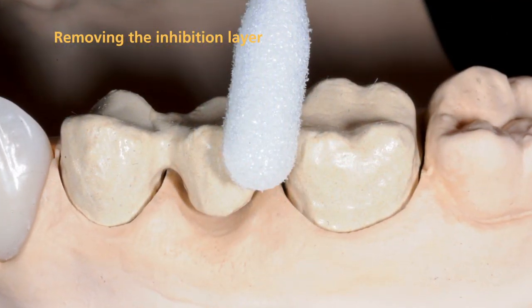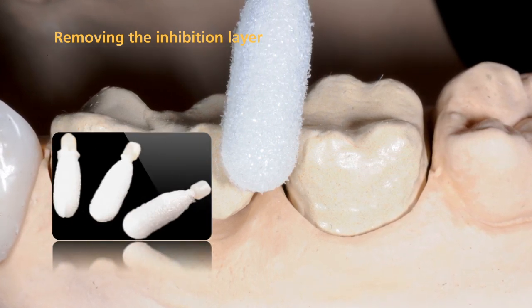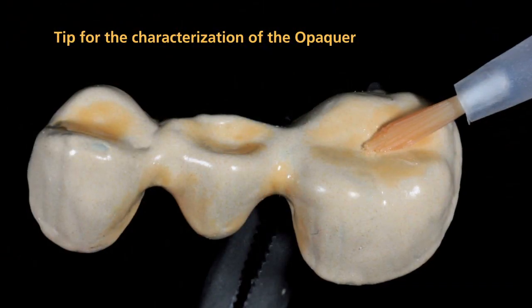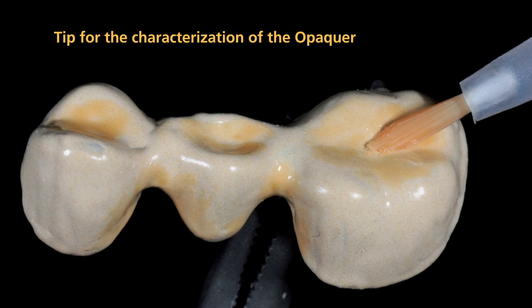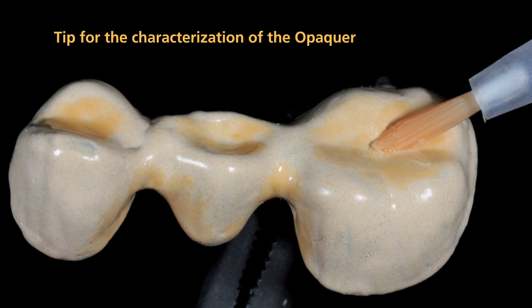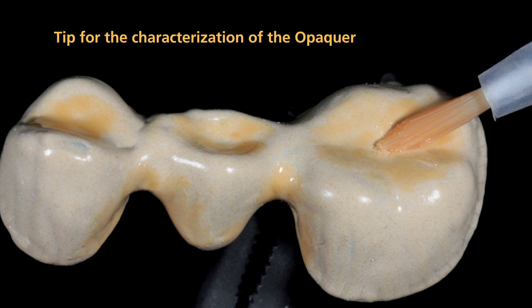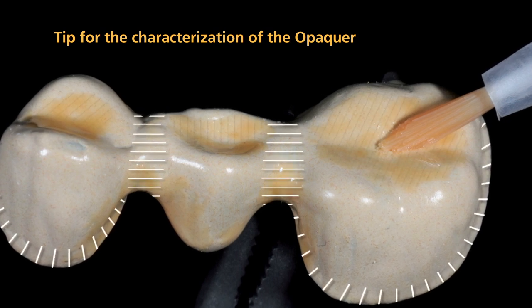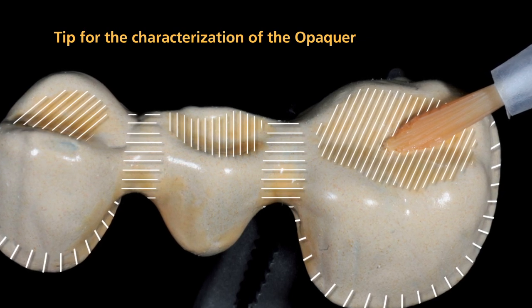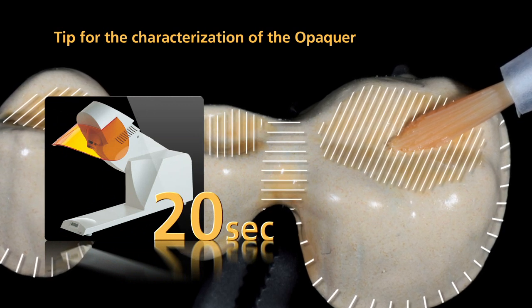Thoroughly remove the resulting Opaquer inhibition layer with a disposable sponge. Make sure that the Opaquer surfaces are free of residue. After you have removed the inhibition layer, you may characterize or modify sections of the Opaquer surface with SR-NEXCO stains. It is recommended that you apply a thin layer of stains to the marginal and interdental areas, particularly if space is limited, to enhance the in-depth shade effect. After that, pre-cure SR-NEXCO stains for 20 seconds with the quick.